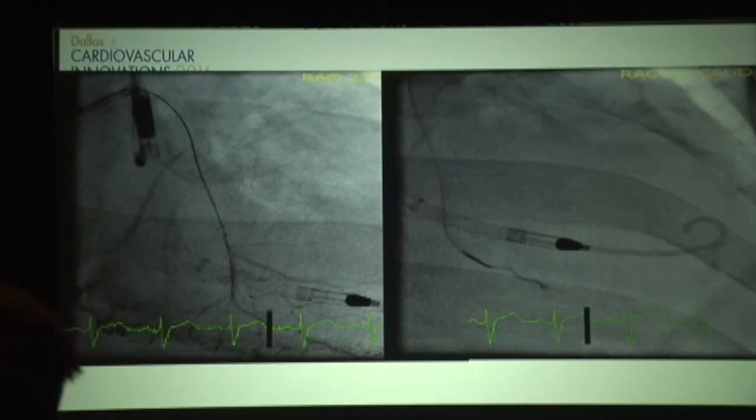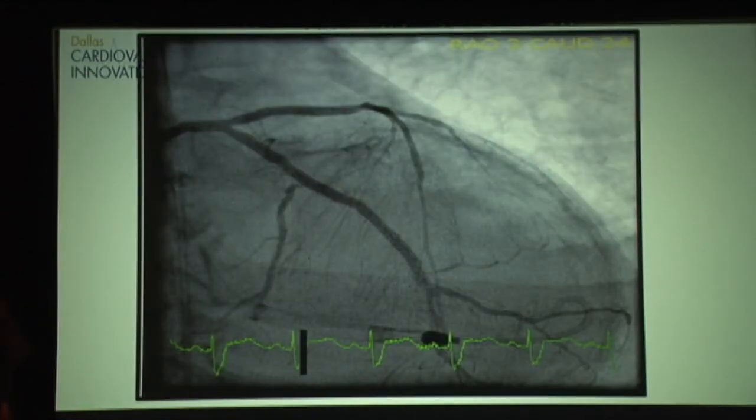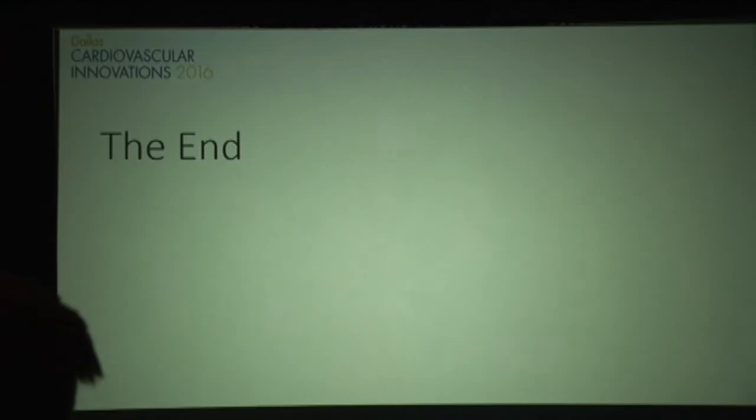This is actually the Stingray wire. Distally, we thought we were in, but we had thought that before, so we actually brought the Corsair catheter, aspirated it, we could get blood. We thought we were in the right place, took a little angiogram here to prove it, and then exchanged our wires. And then two stents, one starting just before the bifurcation, and then another one up in the mid-vessel, and that was sort of our final results right there.